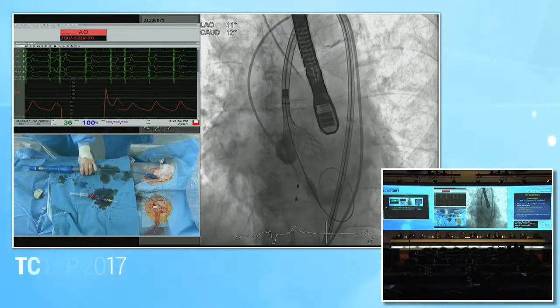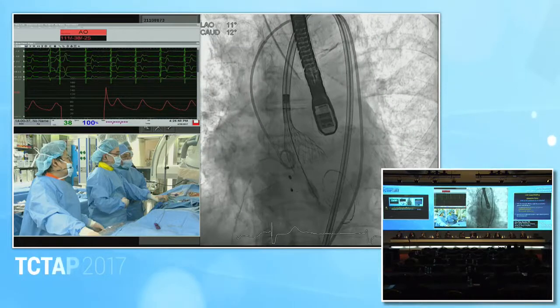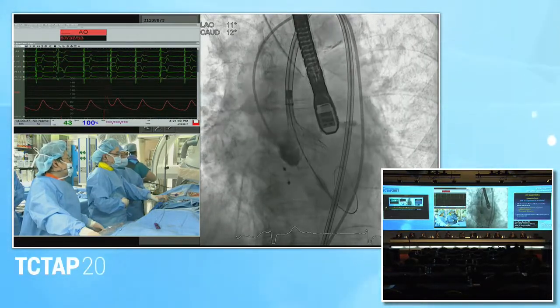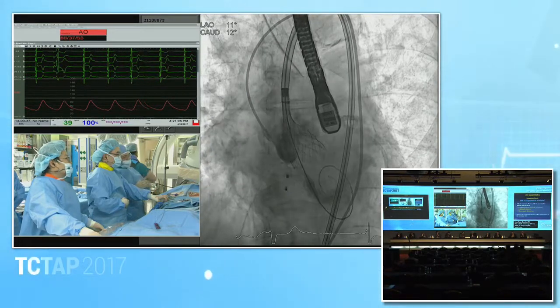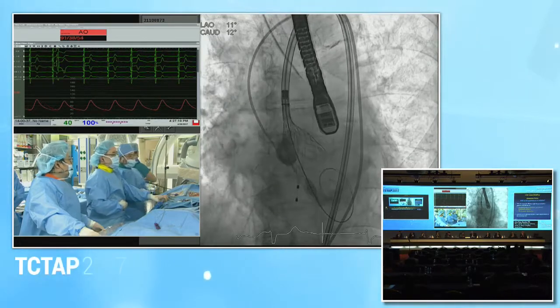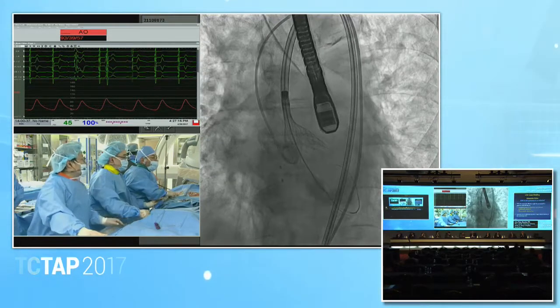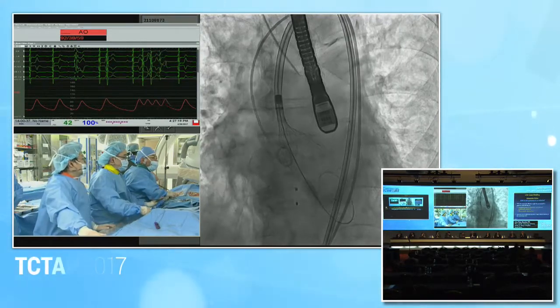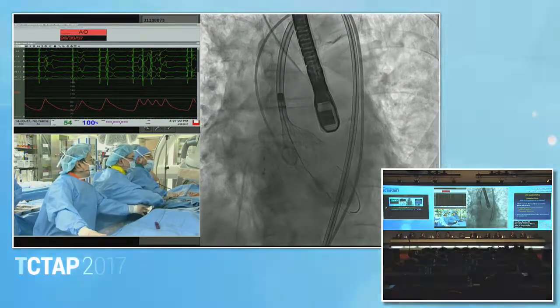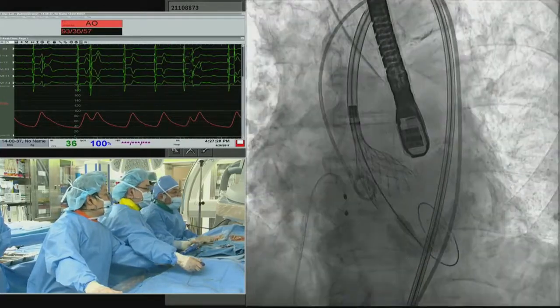You can see this problem here where on the left coronary cusp you're quite a bit deeper than you are on the non. At this moment, I will do the layover. After that, we decide. Yeah. Push the wire a little bit. So your valve is functional there, and you still have it captured. So you could recapture it if you had to. So you're just pushing your catheter in order to get it to the greater curvature, with the hope that this will lift up the left coronary sinus side.